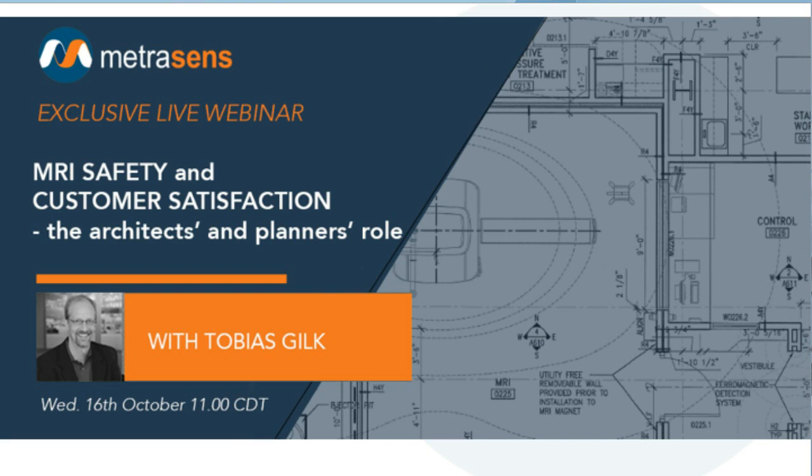The thickened wall that I talked about before, one of the advantages that I didn't really touch on is, if the ferromagnetic detector has a photo beam that connects detectors on either side of a door opening, once that is 16, 18 inches away from or in front of the door, what that means is that the person who's going through the door essentially is going to break the beam, step into the detector area, and be screened before the door is opened.